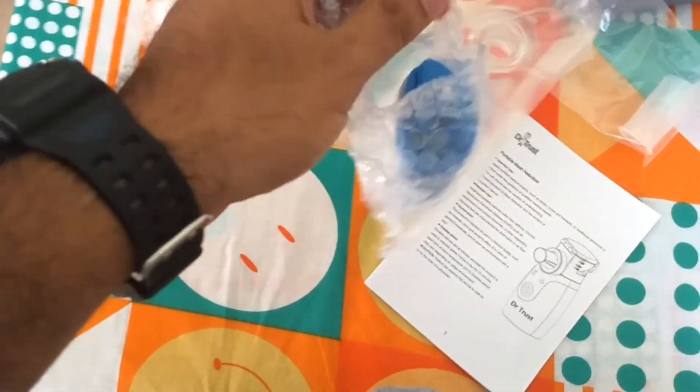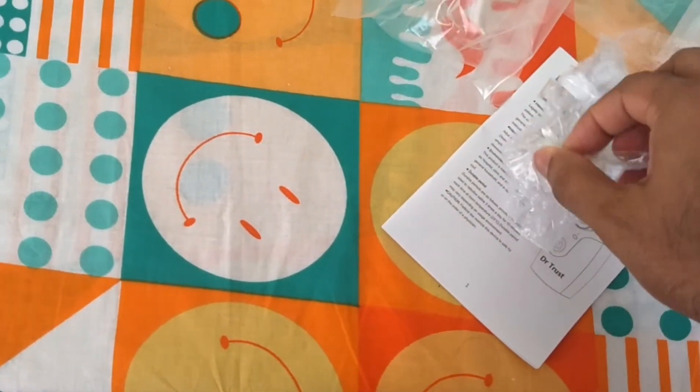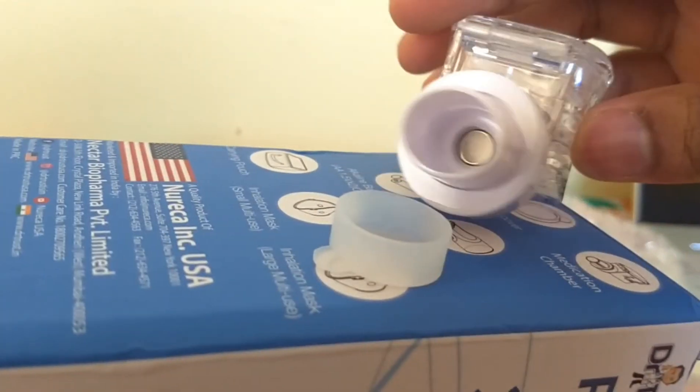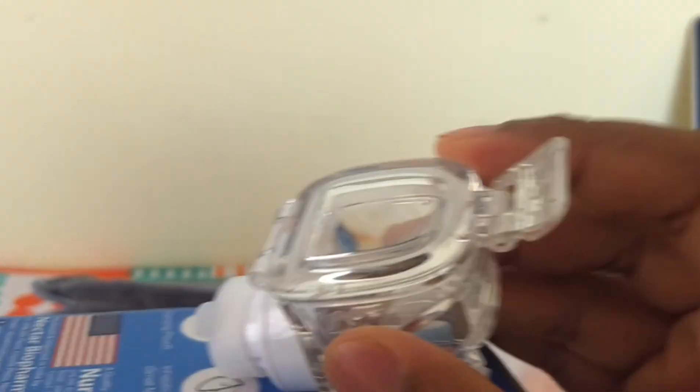Let me open the main unit — the nebulizer machine. Here is the medicine chamber. Since it is a glass chamber, we can see the medicine inside. We can feel the quality. It has a rubber cap, and this is how it can be opened.